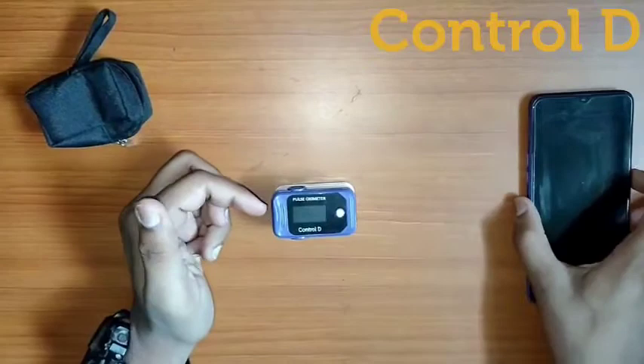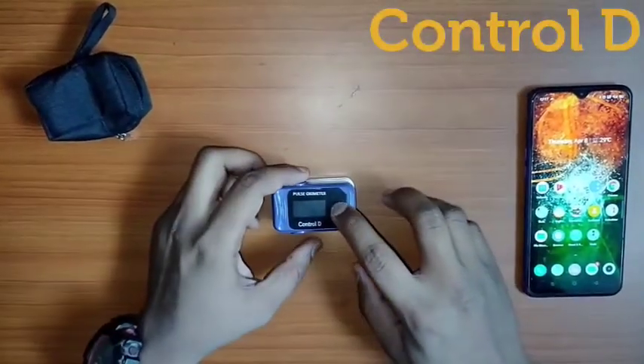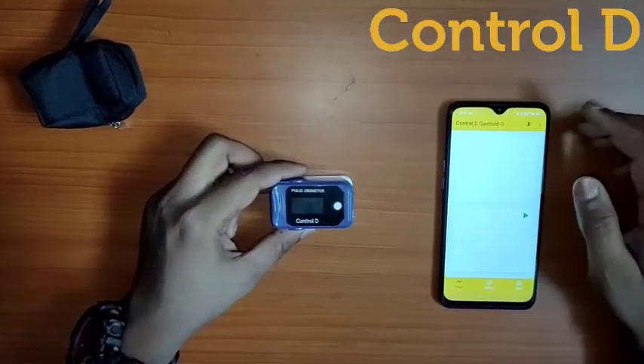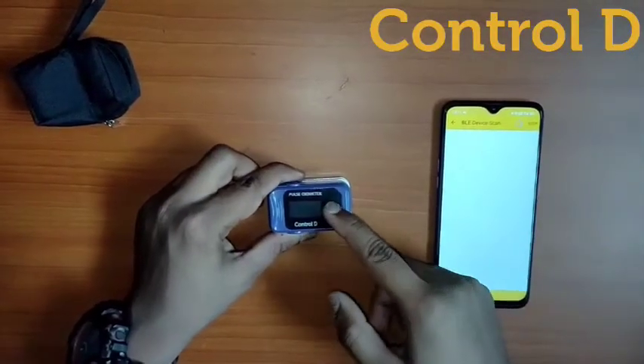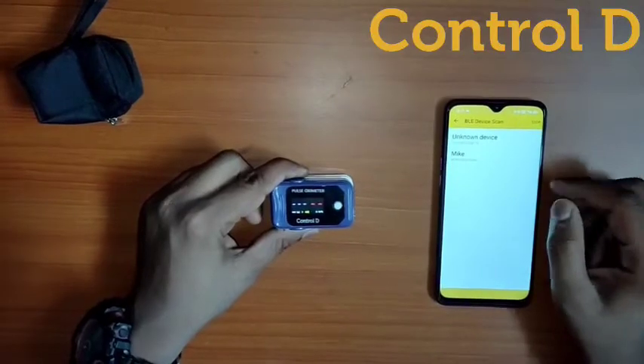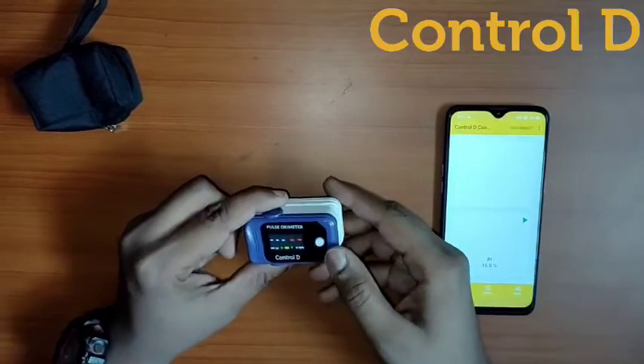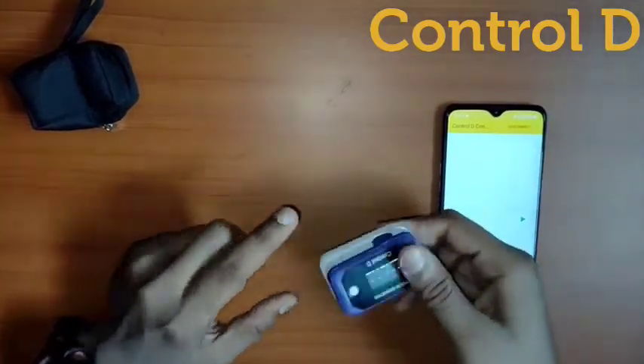You may open your phone and search for the app which Control D provides you. When you open the app, you will get the Bluetooth notification. You just need to turn it on, and the Oximeter itself shows the notification on the screen of your device.